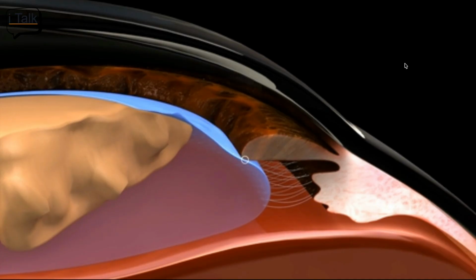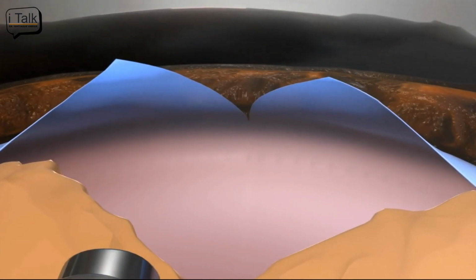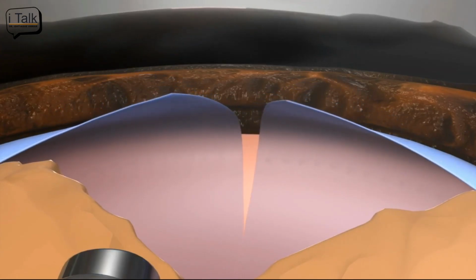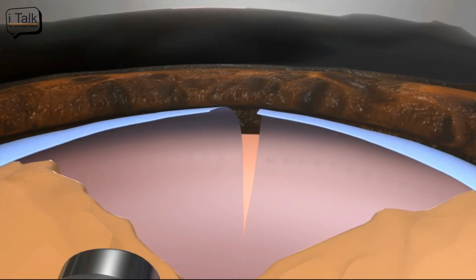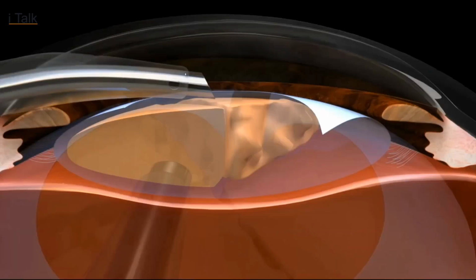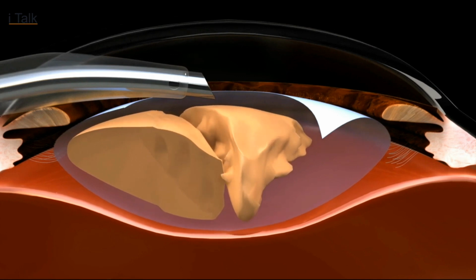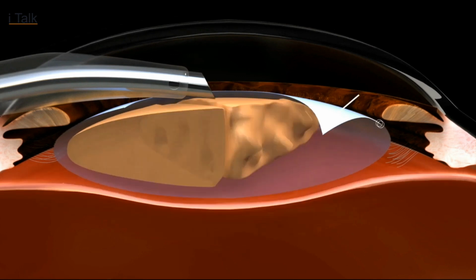So there's a fluttering and everted flap. And if by any means it becomes a wraparound tear, then the fulcrum has gone behind or around, which it has to rotate. Since it is not able to move, it becomes flat, inverted, and non-fluttering.